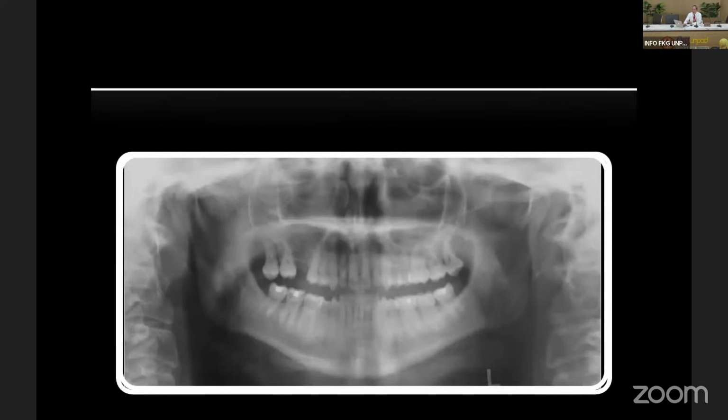Now, this is another case. If you look at this panoramic radiograph, the chief complaint of this patient is pain in the right side of the maxilla. With this panoramic radiograph, do you see any abnormality?